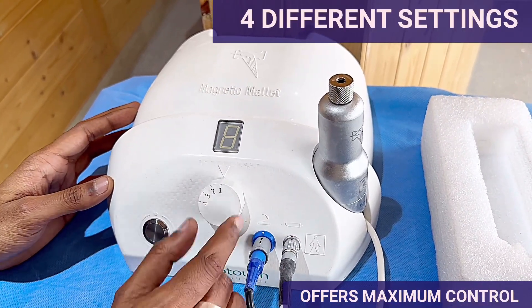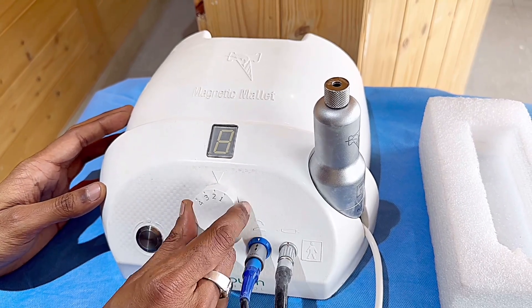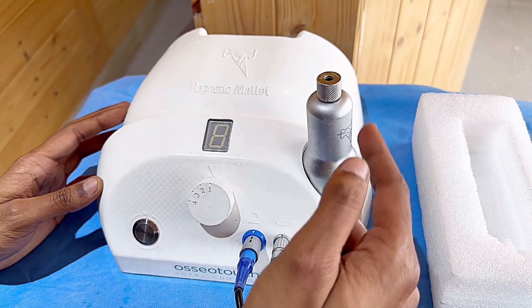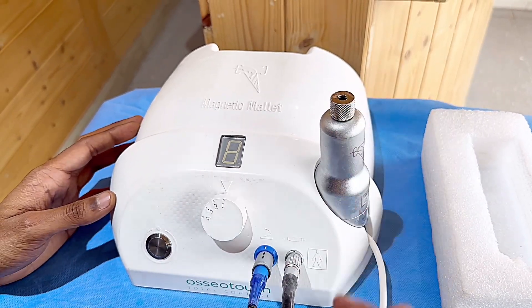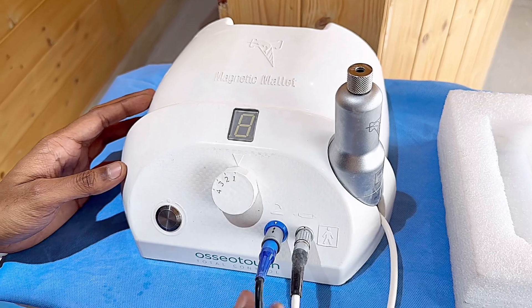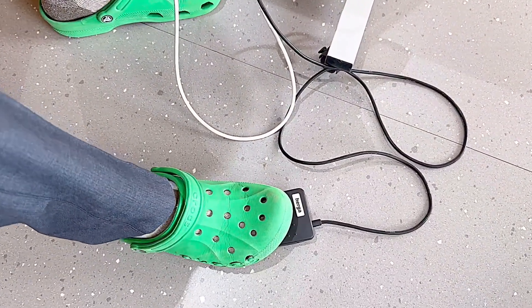We have 4 frequency settings: 1, 2, 3, and 4 — controlled by a single knob. This is the handpiece attachment stand; after surgical work we can place the handpiece here. This is the input, this is the output, and this is the simple and very elegant foot pedal.